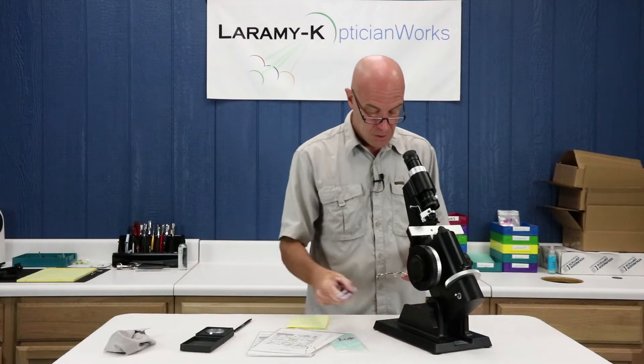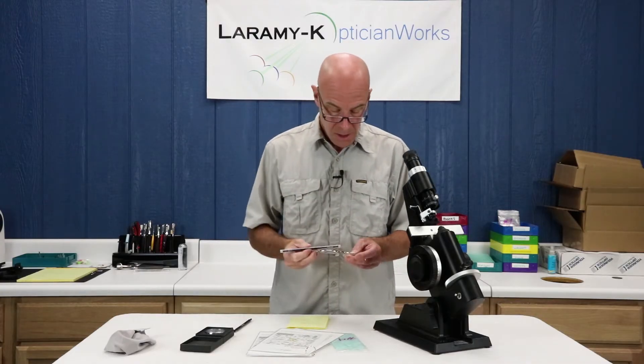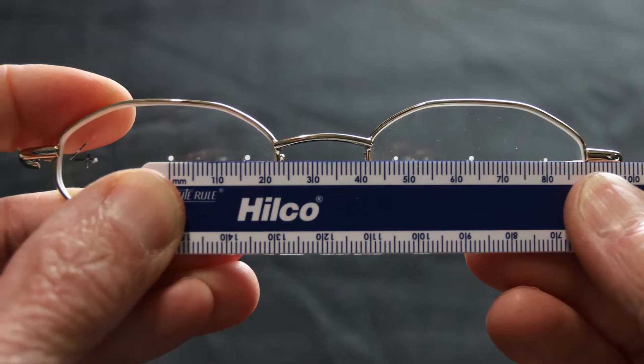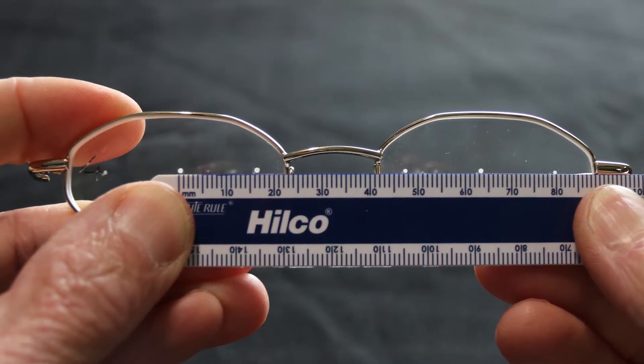As I mentioned, there'll be two additional things we're going to do. First, we're going to measure the distance between our two center white dots, and that gives us our distance PD. I have got a beautiful, perfect 64 there.